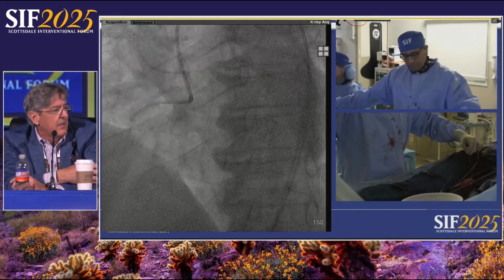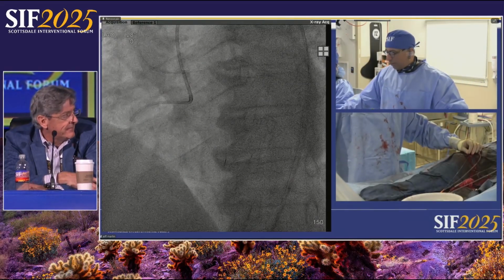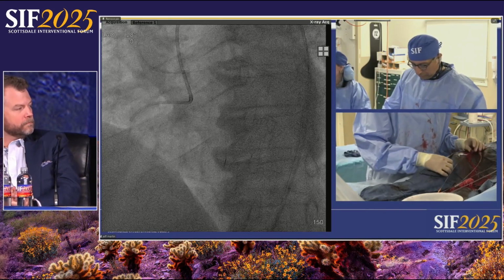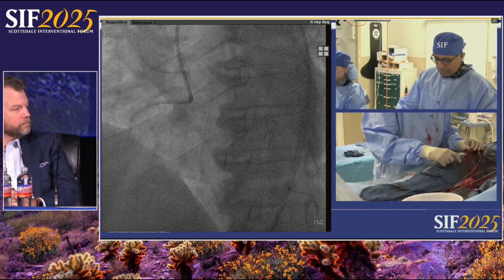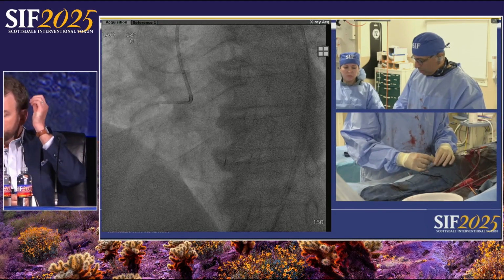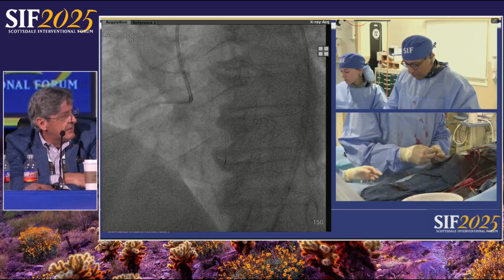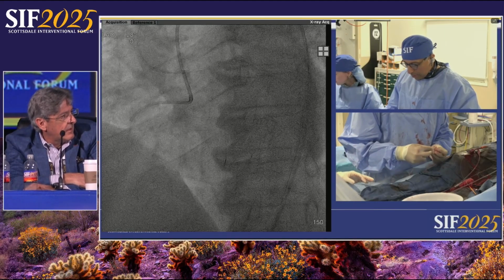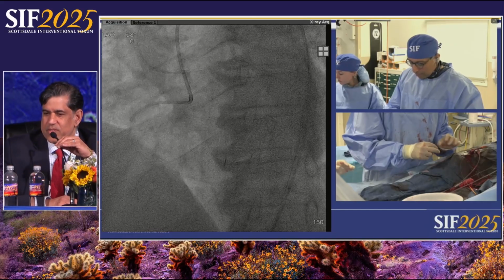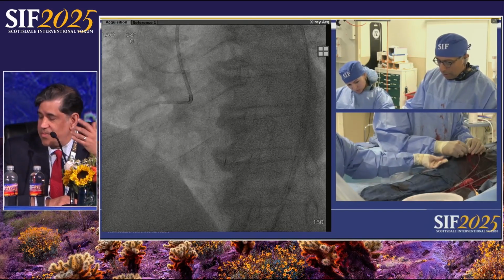At the end of the day, do your best. And I think because you have the imaging, this is key. You would never know that ahead of time just by the NC balloon profile, so the eccentricity is super important here. You could upsize your rotoburr, you could do IVL, you could do scoring. Lots of things are on the docket here, but you had to have that image, and even if it's low quality in terms of transducer resolution, this is bulky enough that it's obvious, and you made a big impact.